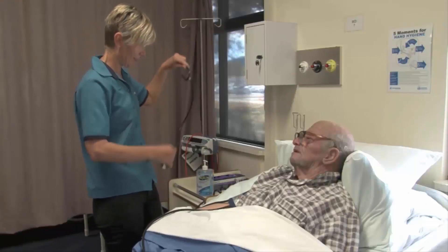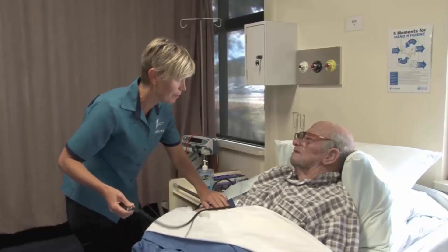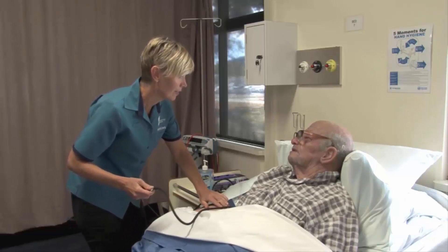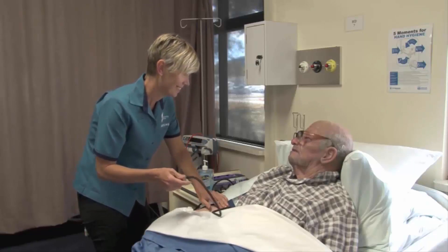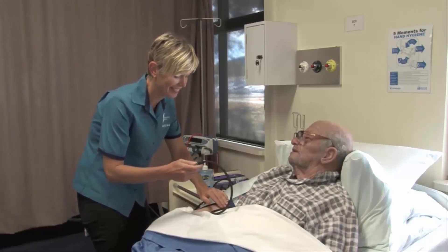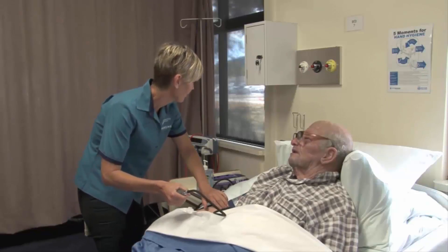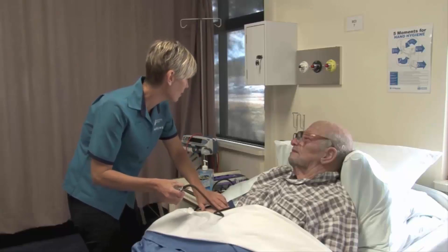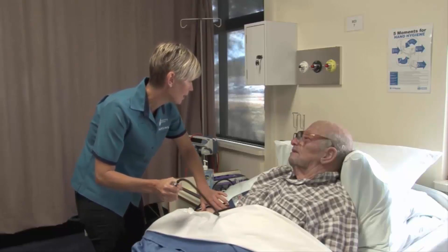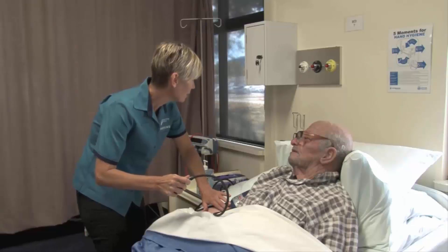For this first part I just need to feel the brachial artery, and I'm going to puff the cuff up. I'll give you a tip — righty tighty, lefty loosey: if you go right it blows the cuff up, and if you go left it lets it down. I can feel that pulse there — it's nice and strong. I'm going to inflate the cuff until I get to the point where I can't feel your pulse anymore, because the pressure of the cuff occludes the pulse.